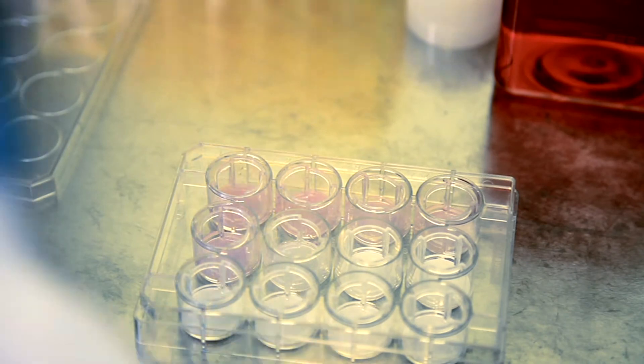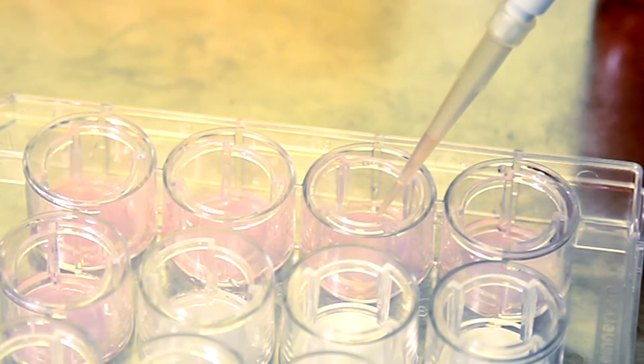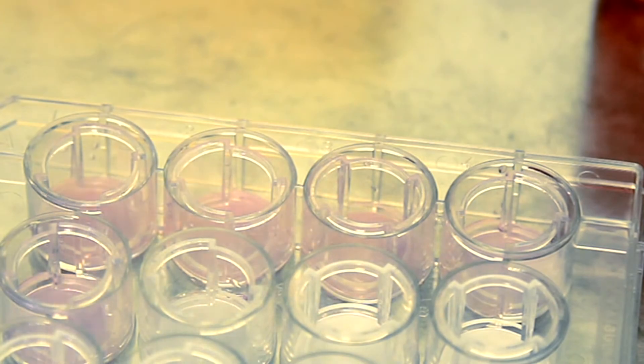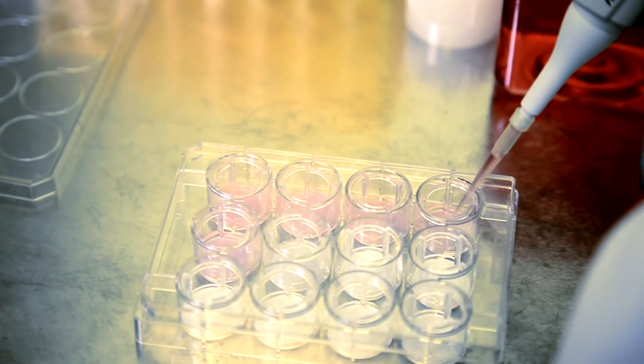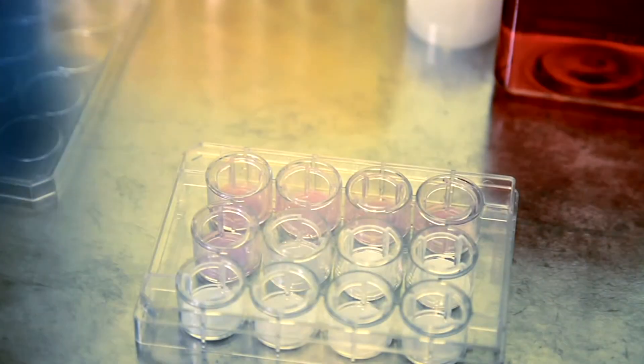When ready, seed the cells on the middle of the disc, being careful not to touch the membrane. 3D cell culture is different from conventional 2D cell culture, as the cell seeding density must be optimized according to the cell type.